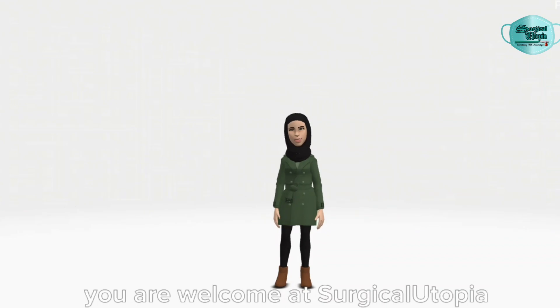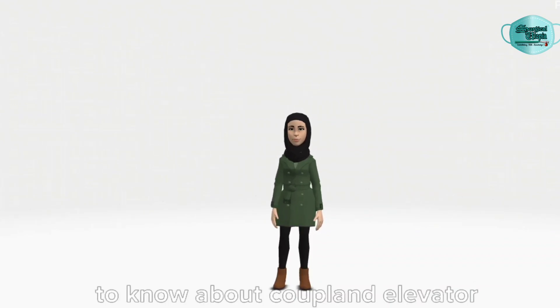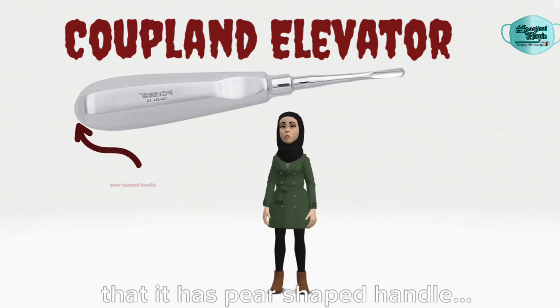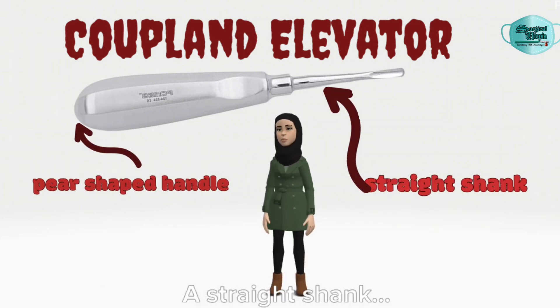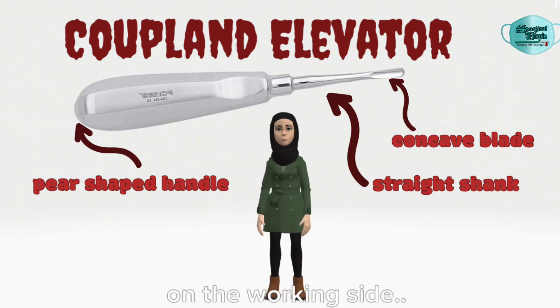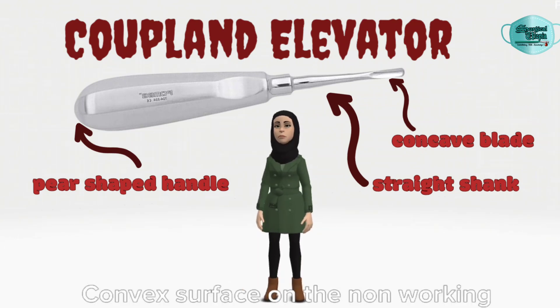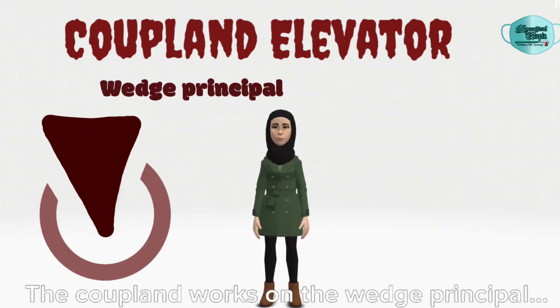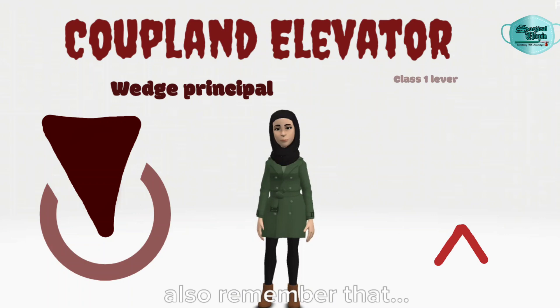Hello everyone, you are welcome at Surgical Utopia to know about the Coupland elevator. The Coupland elevator is designed such that it has a pear-shaped handle, a straight shank, and the blade has a concave surface on the working side and a convex surface on the non-working side. The tip of the elevator is sharpened straight.